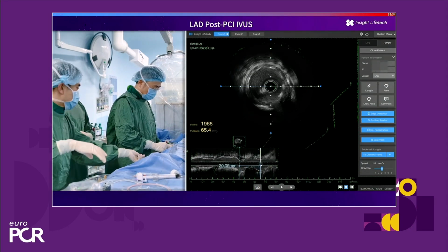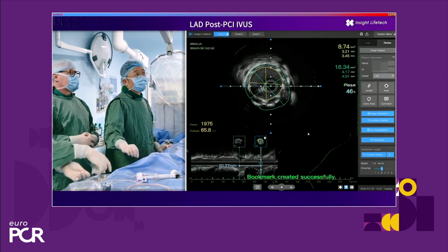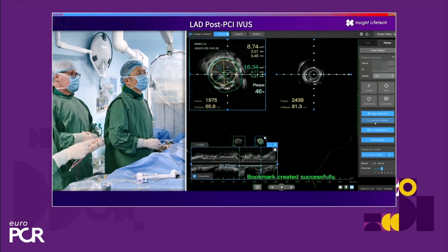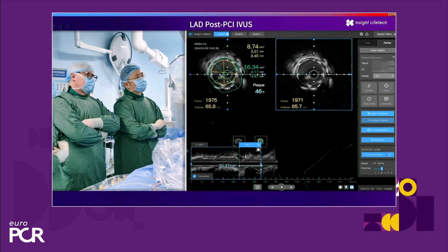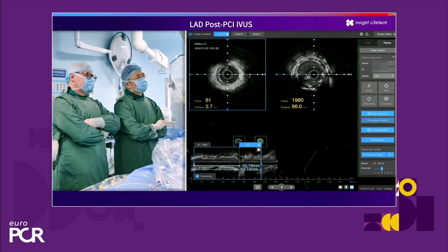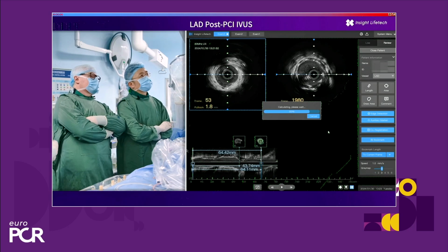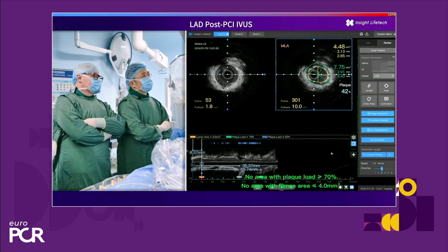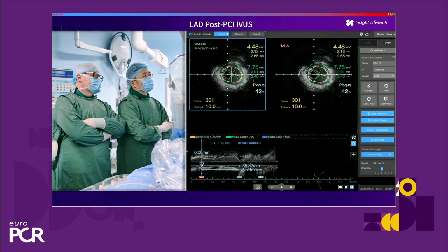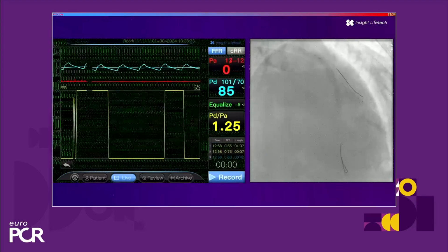However, you can measure with automated assessment what is the minimum in-stent area. So you should mark distal edge of the stent and then proximal edge of the stent, and let's try to calculate the lumen area inside, what is the minimum lumen area with automatic assessment, which is now performed, and we will check for minimum in-stent lumen area, which is 4.48, and we have some small zone of the lumen area which is below 5.5, but it's not too long, and it's in a small vessel because this is distal reference.